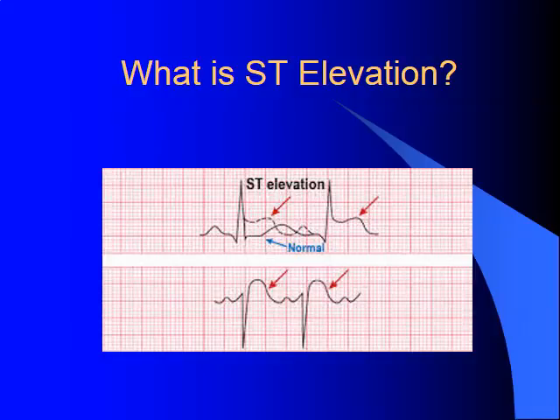As the study in the last lecture pointed out, STEMI mimics are a much more common finding in the hospital and pre-hospital setting. So that's why STEMI mimics occur in our 7-step method before our actual spot where we look for our ST elevation MIs, because we want to always have in the back of the mind, could this ST elevation be caused by something other than a myocardial infarction or an occluded artery?